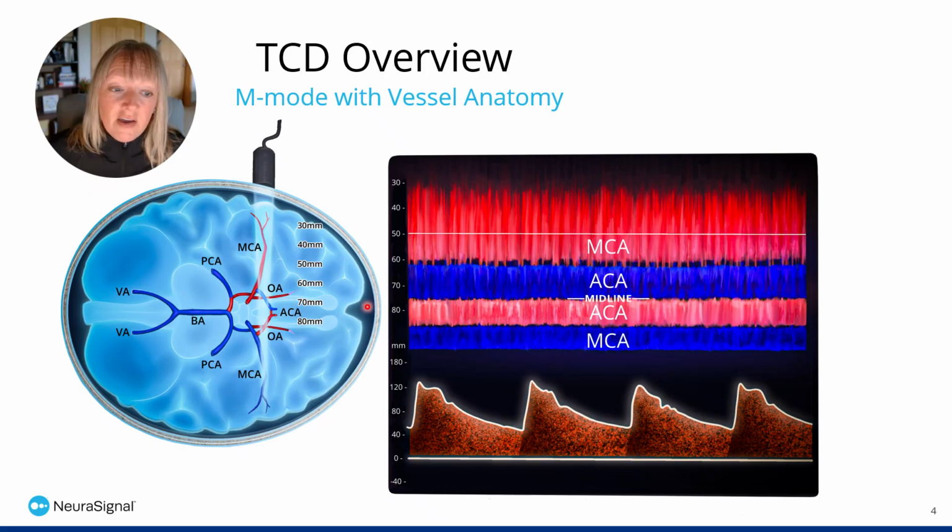At 75 millimeters, it's typical midline of an adult skull. So always be aware at 75 to 80 millimeters, that is going to start the other side of the head. So we have our MCA on the left, ACA on the left, our right ACA and our right MCA.